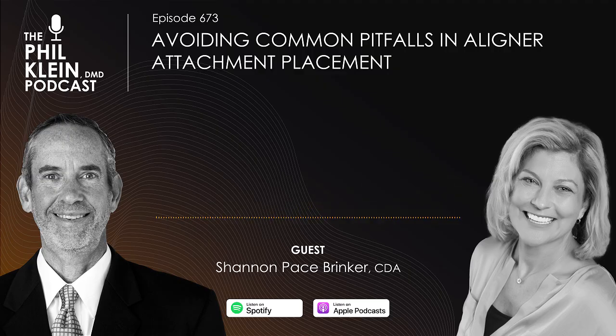And I train team members, when you put that template on, one of the things that happens is the composite starts to squeeze out, come out a little bit. So I take my Optra Pad and I basically trace the outline of the composite template window. What that seems to do is push the composite back into that pocket. And that's why I love that instrument. I cannot do without it because I trace every attachment while I'm holding it down. And I don't cut the template. I told you we don't cut our template because I'm using the fact that I've got a full arch template.